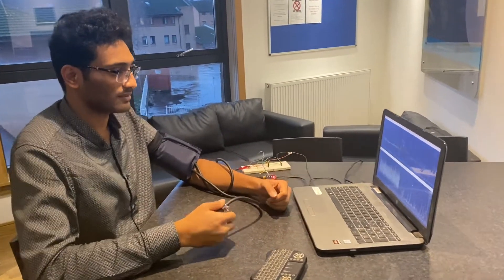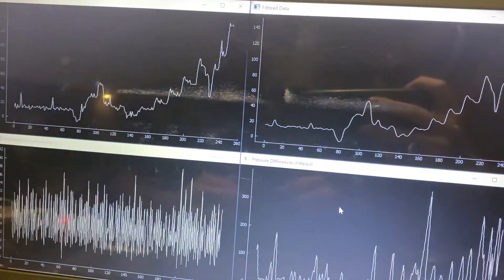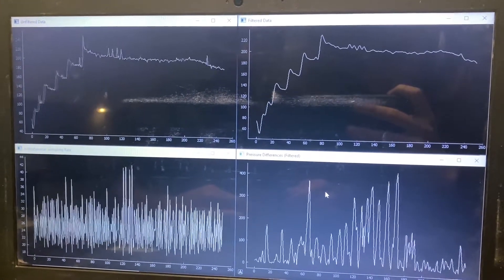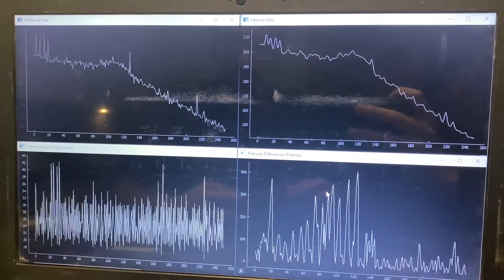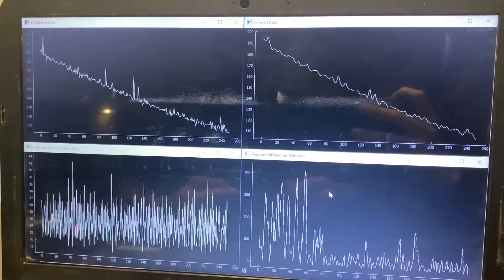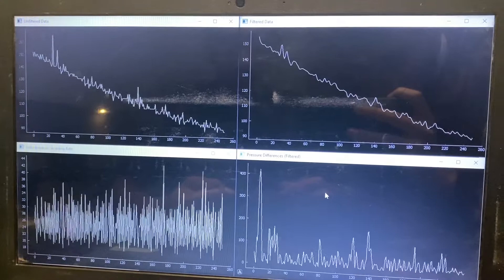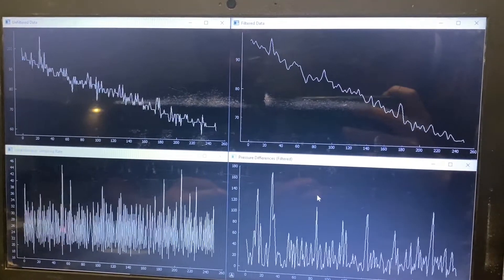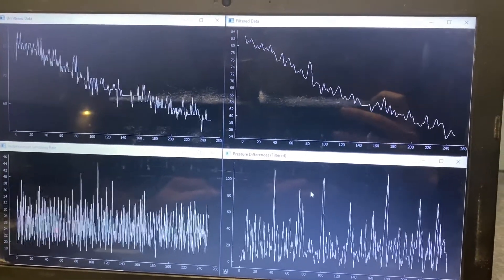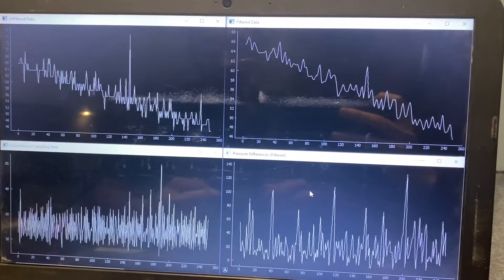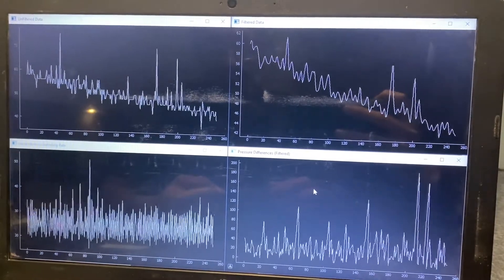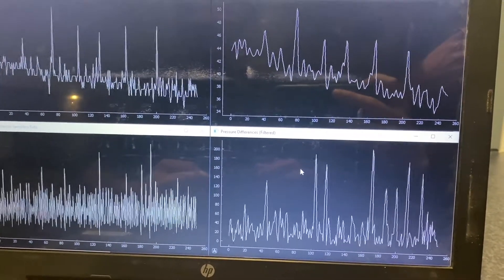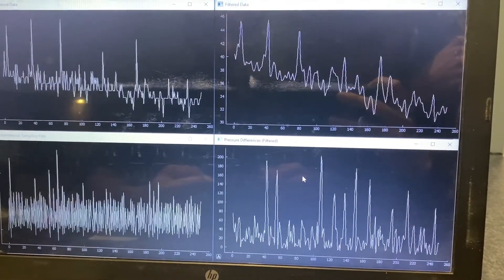We have now inflated to 200 mmHg and are deflating slowly. Around 100 mmHg we observe the mean arterial pressure, and we can see peaks appearing in the pressure differences window corresponding to Raj's heart pulses. Once we move away from the region of interest, we deflate completely.